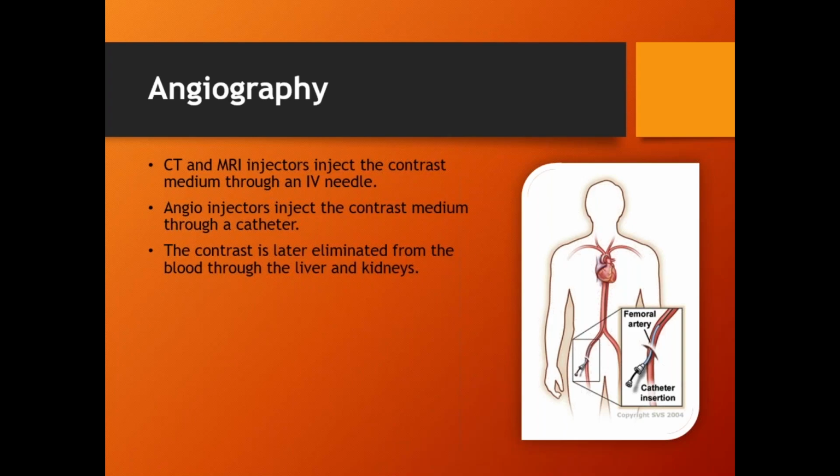An MRI procedure? All right. Compared to an angiographic procedure, think of an angiographic procedure as a snapshot. All right, I'm going to take an image of this. Angiographic procedures are very short shots, literally milliseconds. It's bang and it's over. Hold your breath. Boom.